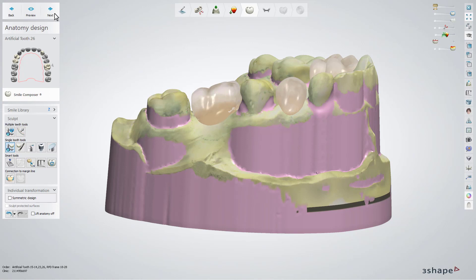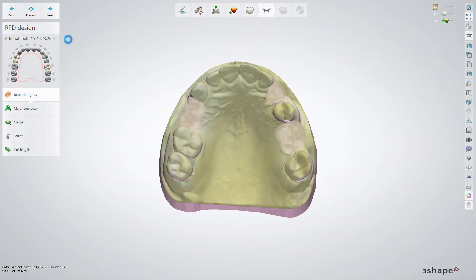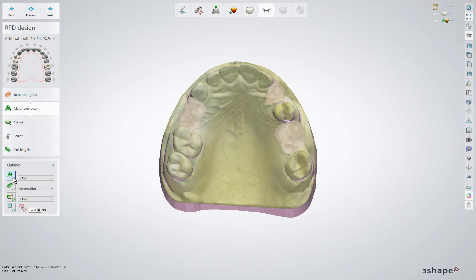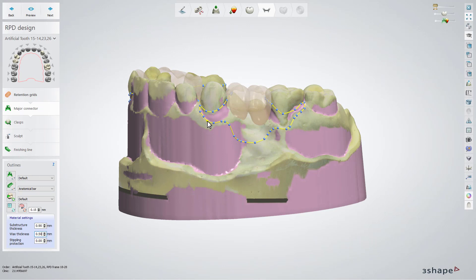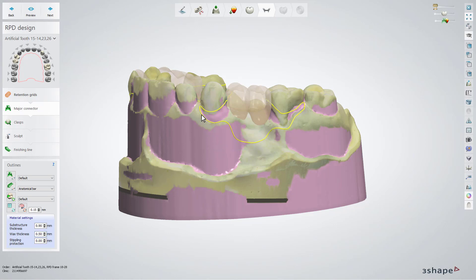Click Next to move further and go straight to the major connector sub-step. Set the thickness for the denture and draw the outline for the denture. Draw the clasps as well, or if you prefer the designed ones, use them from the clasp sub-step. Now you can use the fast edit option to adjust the whole design. Try to avoid making sharp edges while designing the connector.